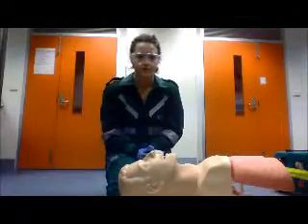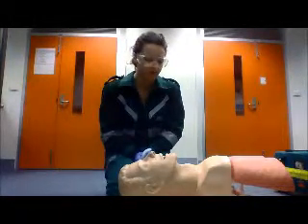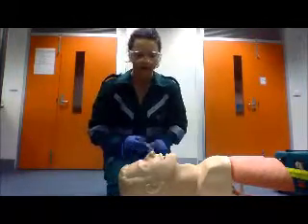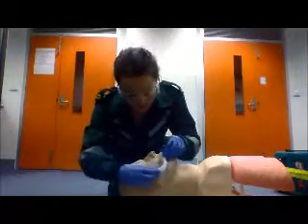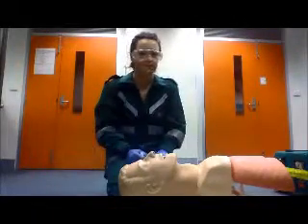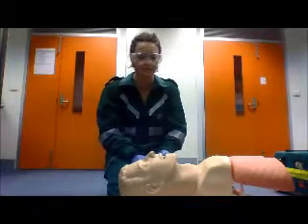I'm now going to demonstrate inserting an OPA, or oropharyngeal airway. The patient should be in a supine position with their head supported. You need to measure the OPA from the corner of the patient's mouth to the angle of the jaw. A contraindication of using an OPA that's too big or too small is that it could occlude the airway or be ineffective.